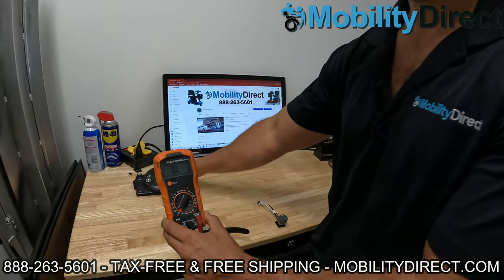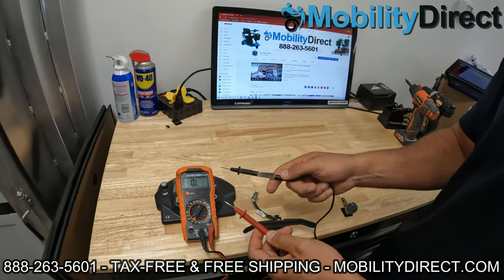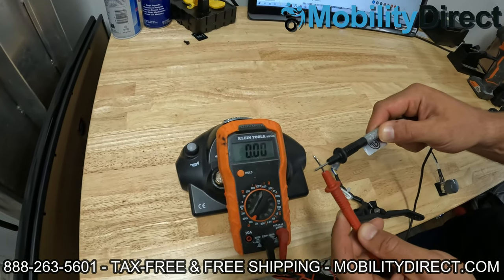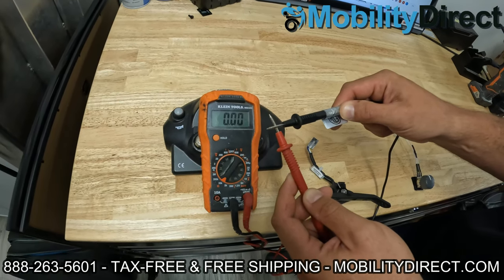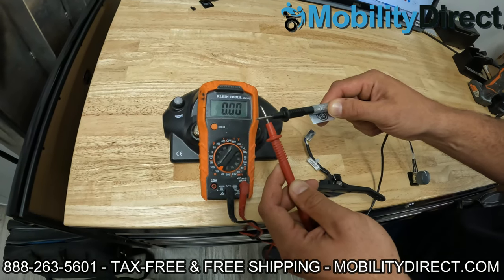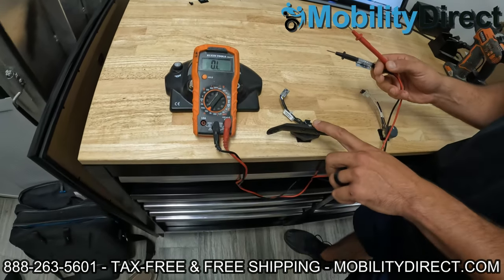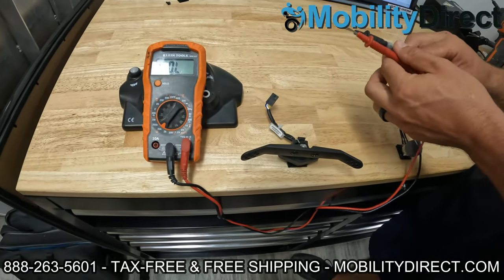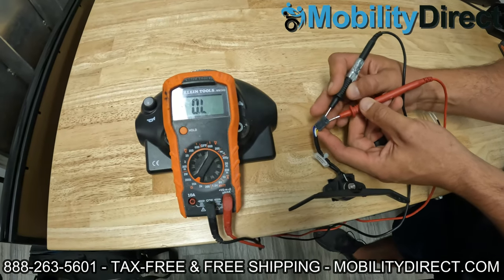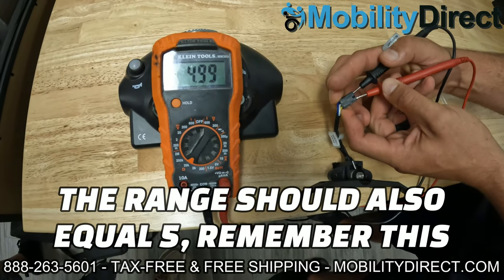Now that it's on 20k, the first thing you always want to do is make sure your probes and your multimeter are working correctly. When you're testing resistance, if you touch them together, you should get a zero on the screen, which shows no resistance because we've closed a circuit. On a throttle potentiometer, you've got three wires. What you want to do first is test the outside two connectors — get those probes in there on the outside two, and you should see a reading of about five on the multimeter, which is what you want to see.